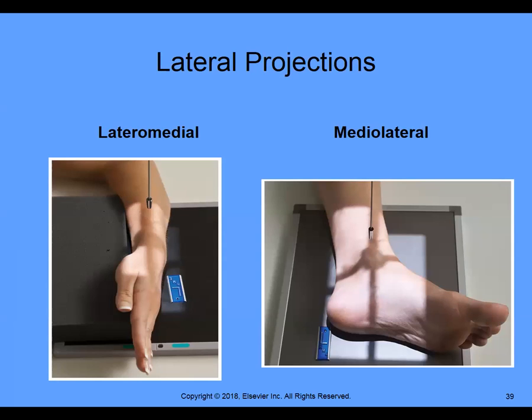Again, looking at a lateral projection. On the lateral projections, we cannot say that it's either AP or PA because we're not entering that anatomical area, anterior or posterior. We're entering the anatomical area or the body part laterally. Lateral, we said, remember, was anything that is 90 degrees. I'm going to write it up here. 90 degrees. So anything that's 90 degrees makes anything a lateral.